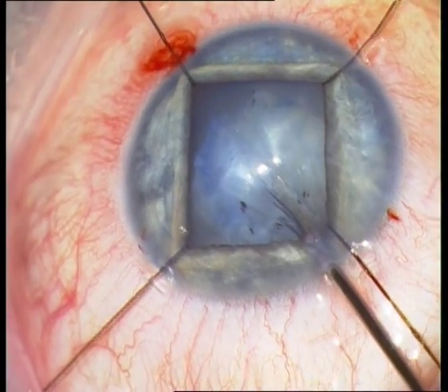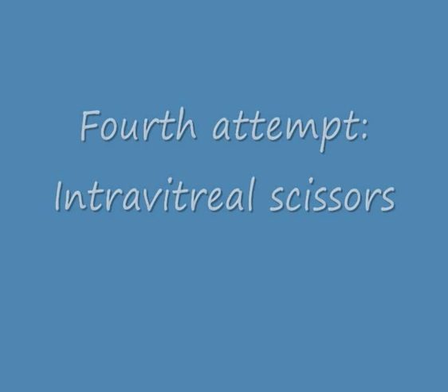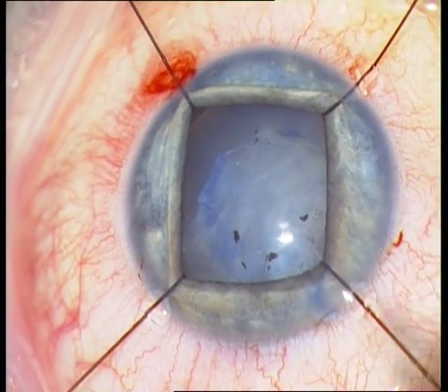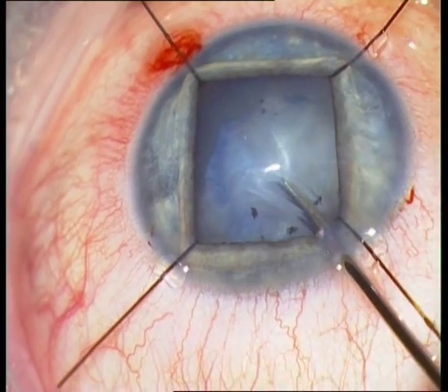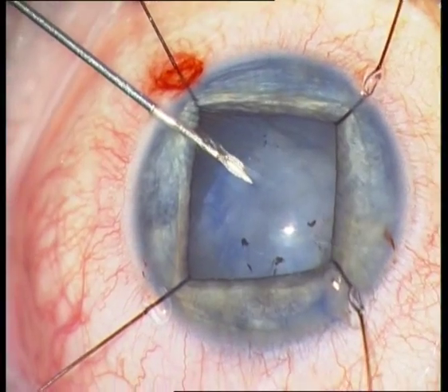So I am trying now to use intravitreal scissors — 23-gauge intravitreal scissors from Dorc — and trying again to open the anterior capsule, but again without success.